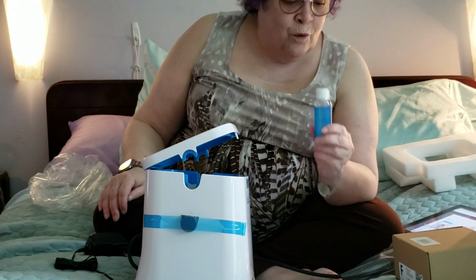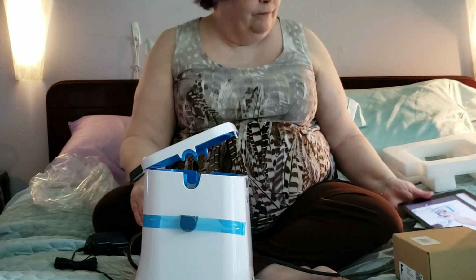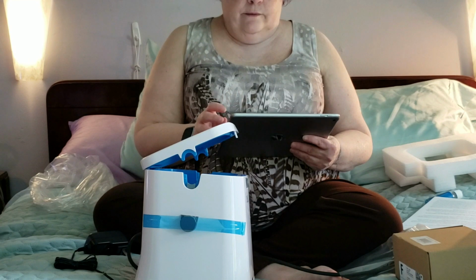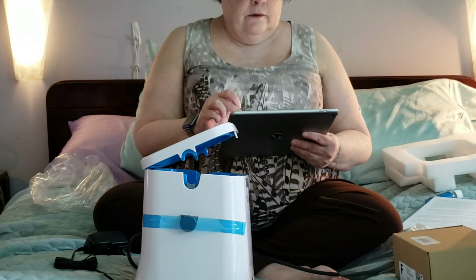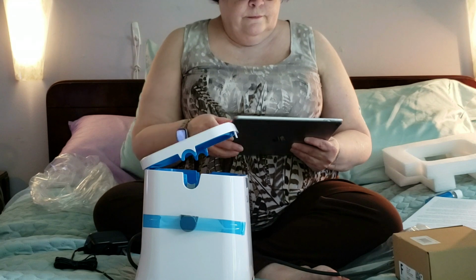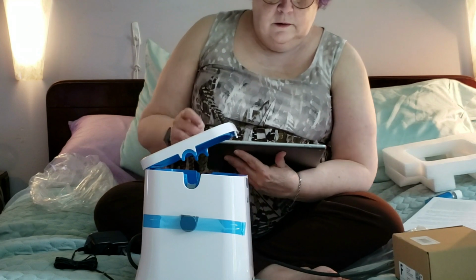Always use the pre-wash whenever you hand wash your current or new CPAP hose, mask, and reservoir. See the owner's manual for more information. I don't have an owner's manual. Let me see if they have one online. Support. Come on. So clearly this part will be edited.